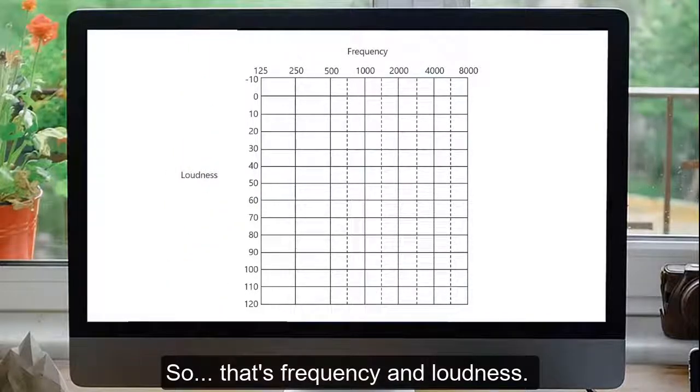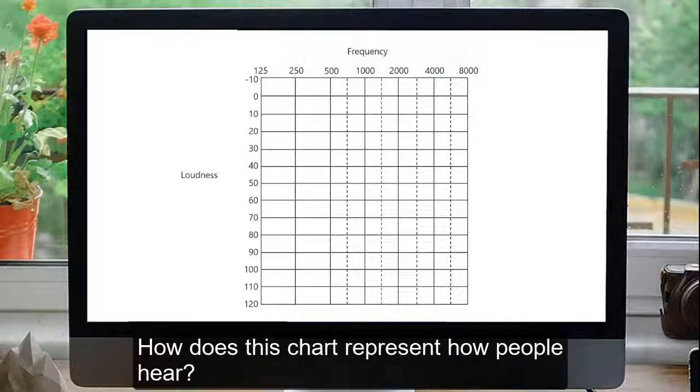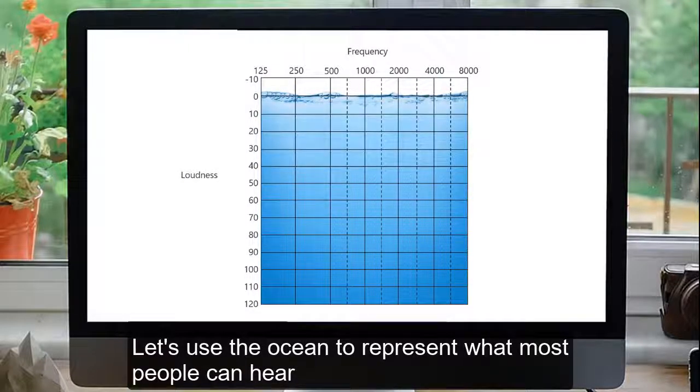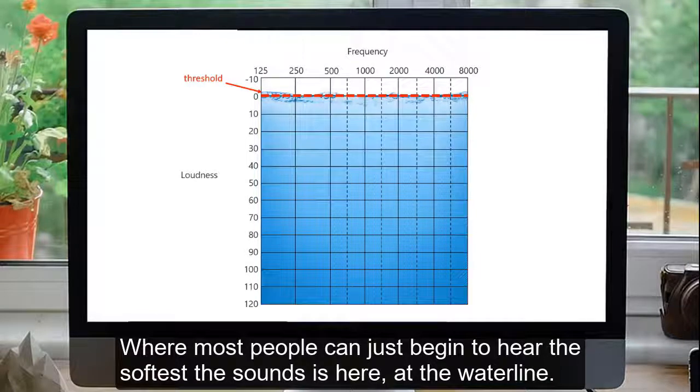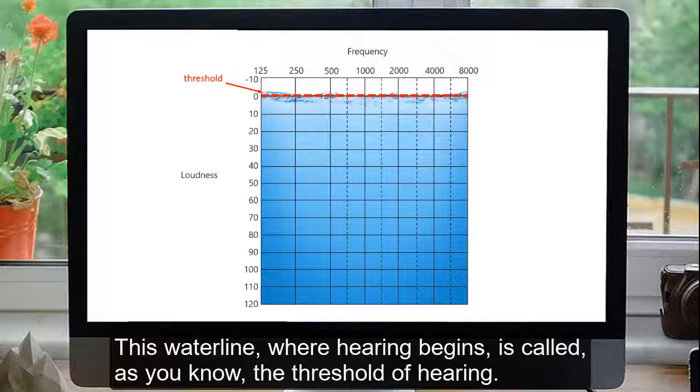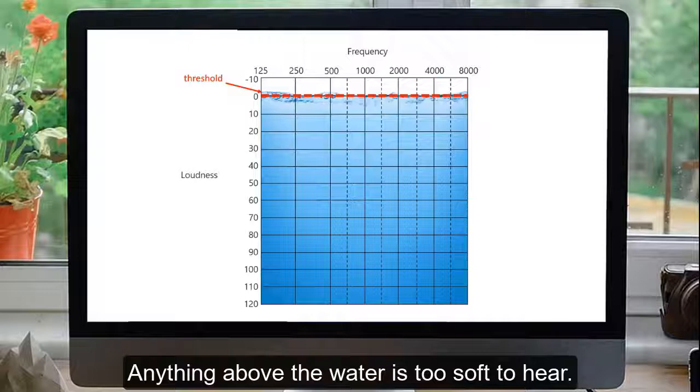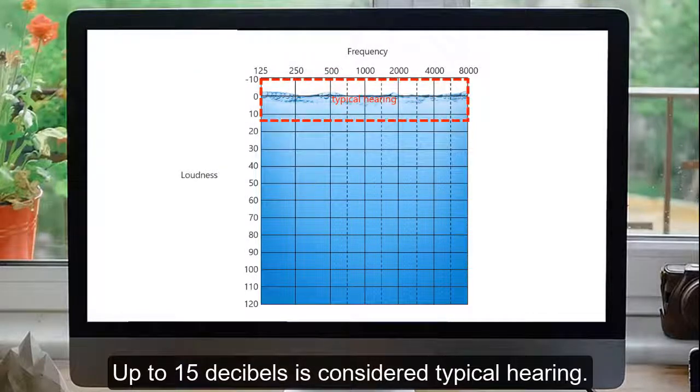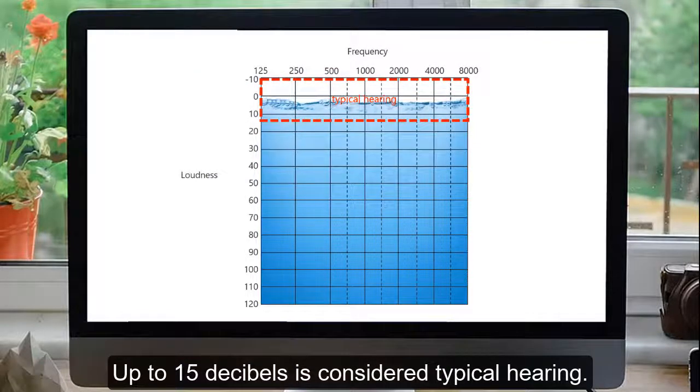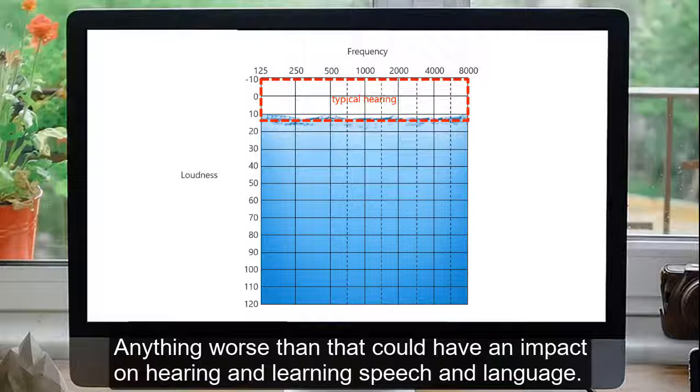So, that's frequency and loudness. How does this chart represent how people hear? Let's use the ocean to represent what most people can hear, and then compare that to the results we have for a child who has hearing loss. Where most people can just begin to hear the softest sounds is here, at the waterline. This waterline where hearing begins is called the threshold of hearing. Anything above the water is too soft to hear. Some people hear better, and some people hear worse than this. Up to 15 decibels is considered typical hearing. Anything worse than that could have an impact on hearing and learning speech and language.